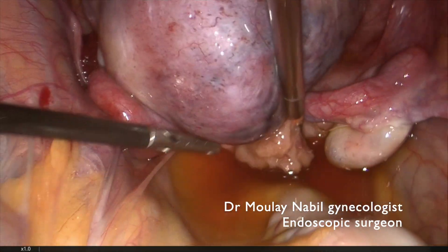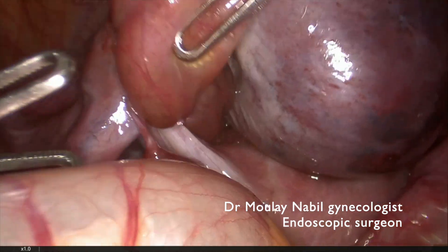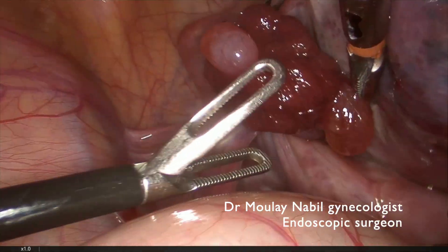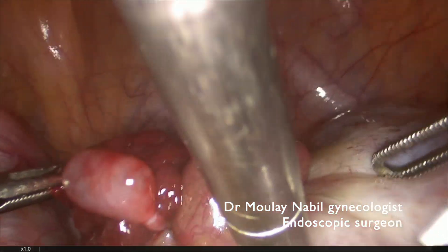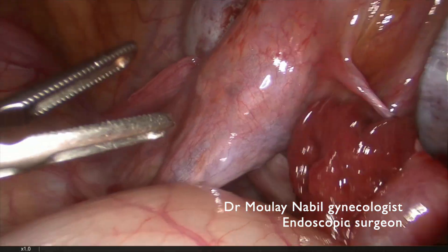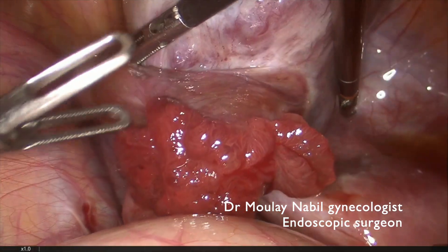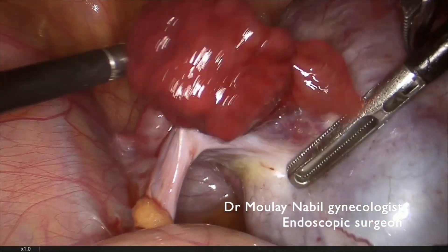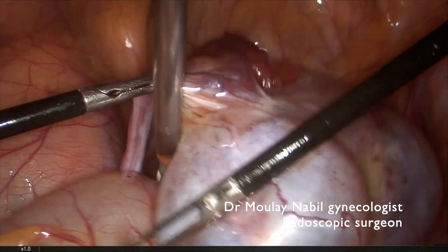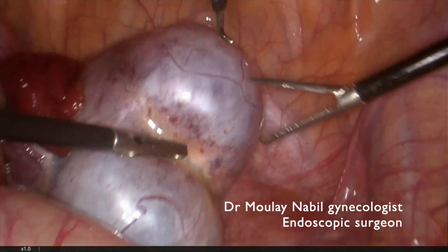This is a case of adnexal torsion on a huge dermoid cyst in a young patient. The first part of the procedure is to try to reduce the torsion, and the movement must be as smooth as possible. The torsion is now completely reduced.